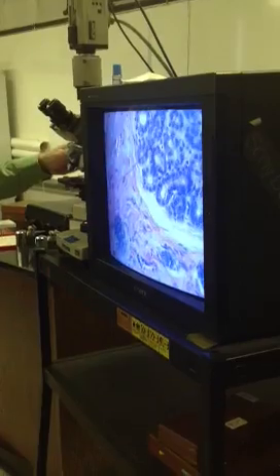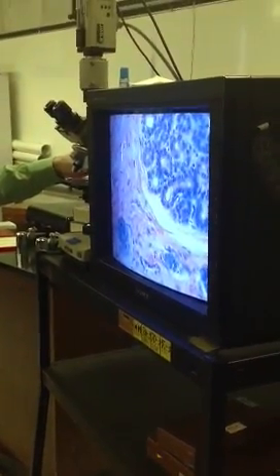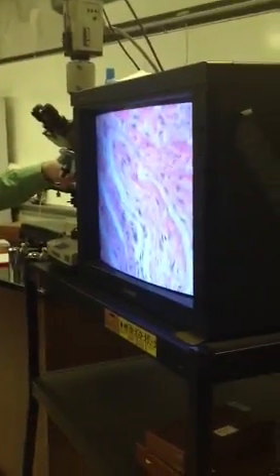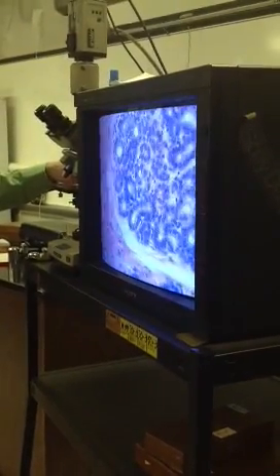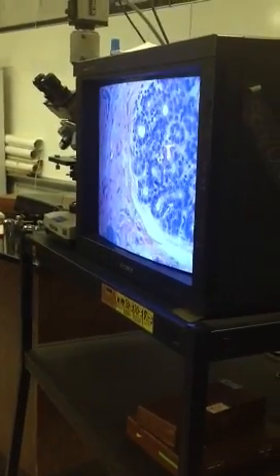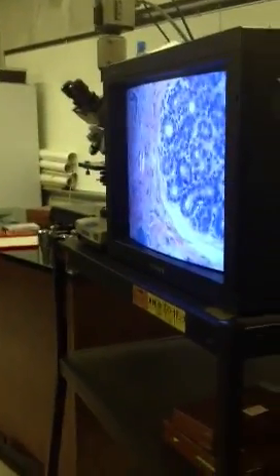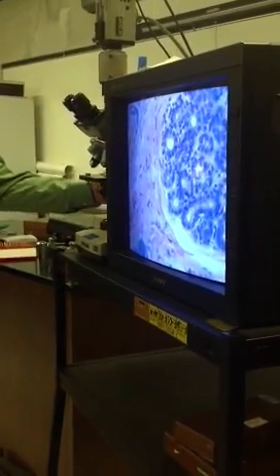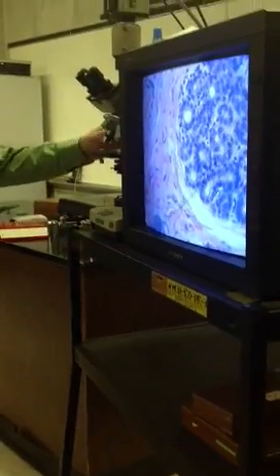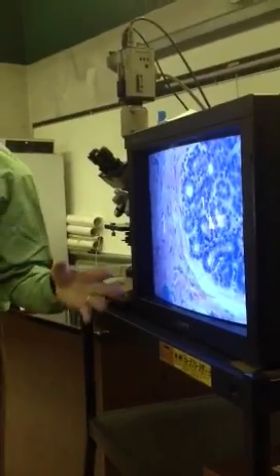which is some connective tissue and some smooth muscle. And what else? Usually, but not always, depending on the section, you'll find some fat too. But the key thing here are these, the ducts. You know, these small groupings, right, hollow places with cells with large nuclei. That's a typical normal duct, right? A typical normal section through a lobule with a lot of ducts.